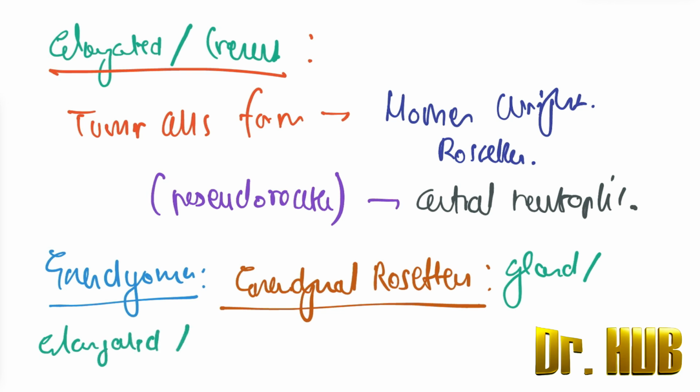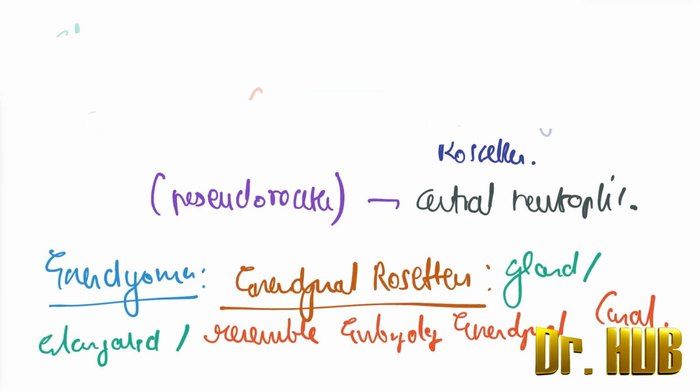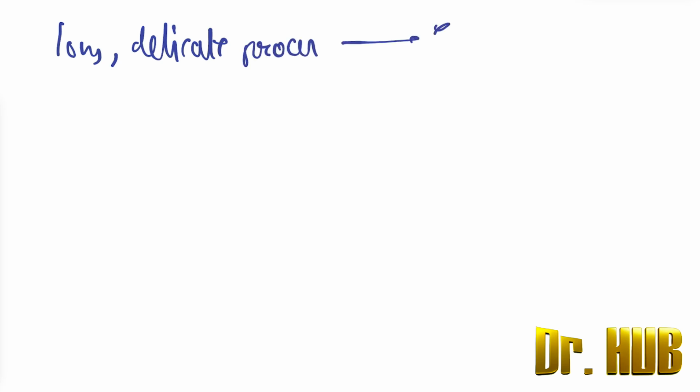They resemble the embryological ependymal canal. They are formed with long, delicate processes, and they extend to the lumen.